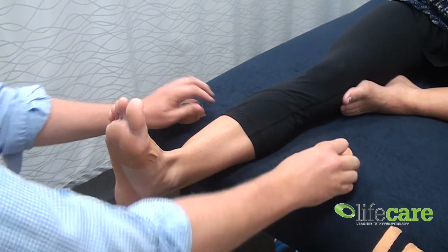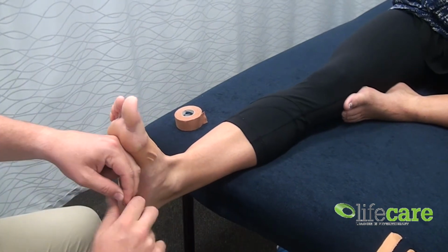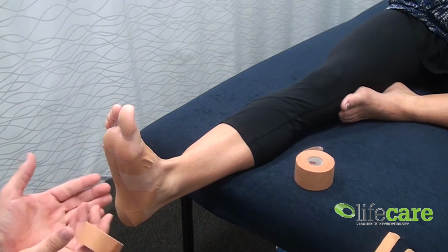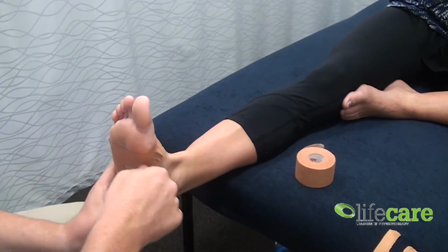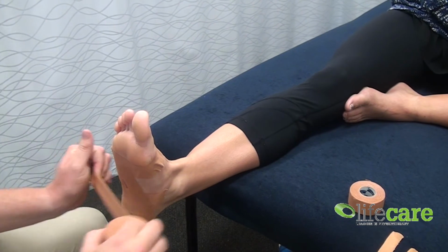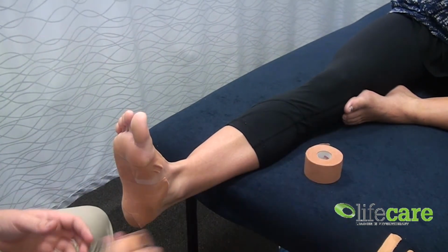And from there we're going to use a basket weave sort of technique where we come across and lay down the tissue. We're going to repeat that several times, so we're basically lifting up under that arch. So it's going to be down the outside, coming round and laying back down. And repeating that process, and usually most of the time we'll do that 3 times just to make sure we get a good lift underneath the arch.